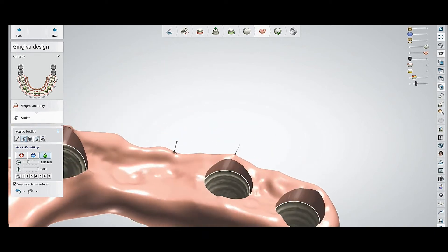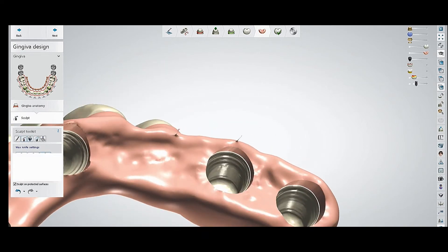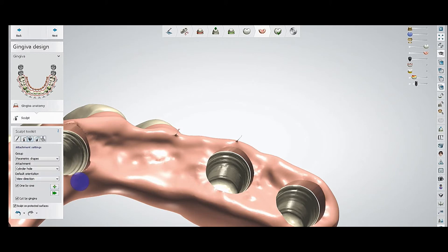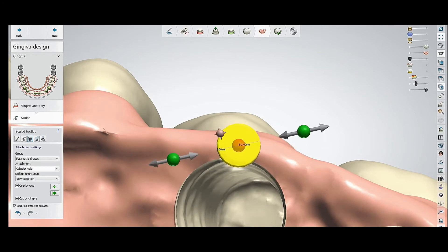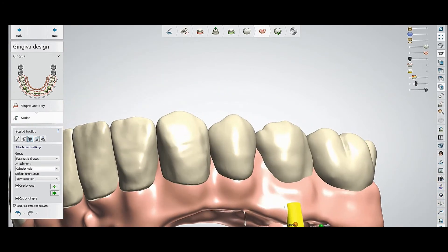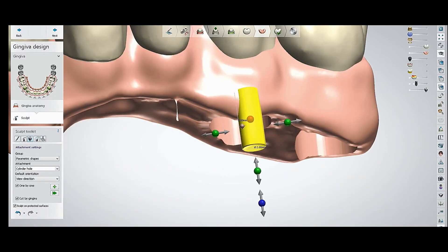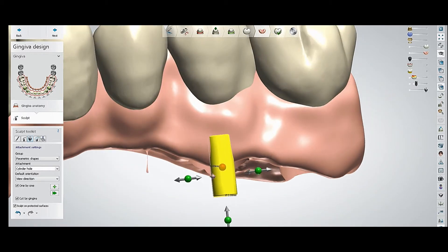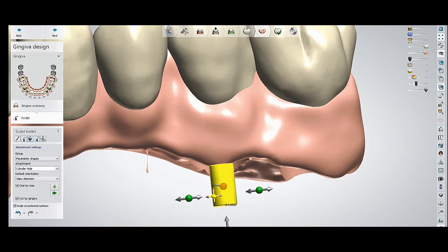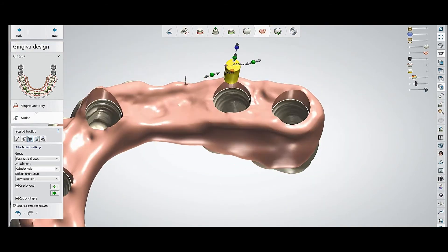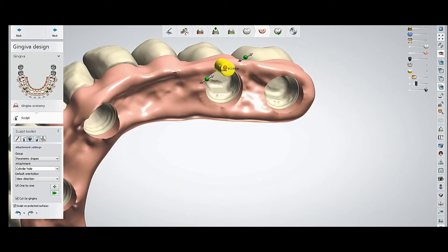Then you can smooth it with the smooth tool, and step by step you can use it on the other areas — place it perfectly.